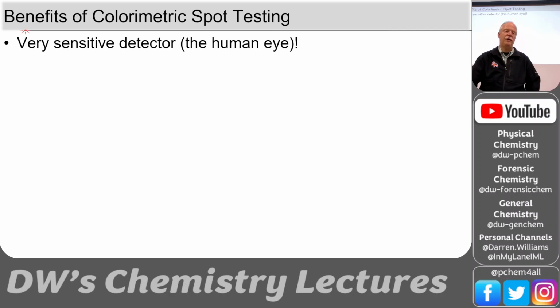Okay, the nice thing about spot testing, colorimetric spot testing, is your eye is very sensitive to color changes, especially in the green region. If you were to take spectra of some of our acid-base indicators like bromocresol green, it's yellow. Well, don't quote me. I think it's yellow in acid and green in base, but it could be reversed. But anyway, the point is it's yellow and green. And you just change the pH a little bit, dramatic color change. You look at the spectra, there's just a tiny little difference in absorption in the green area. And your eye says, whoa, that's a really different color. So not much change in the molecule and the color spectrum can give us a perceived huge change in the color that we get. So it doesn't take much for us to see dramatic differences at the molecular level if color is involved.